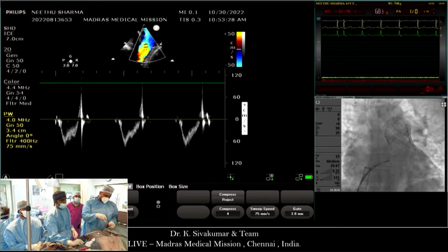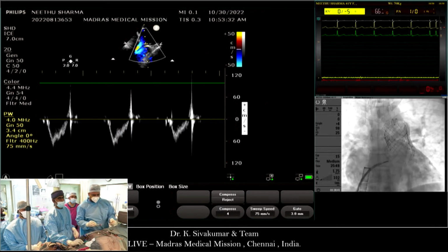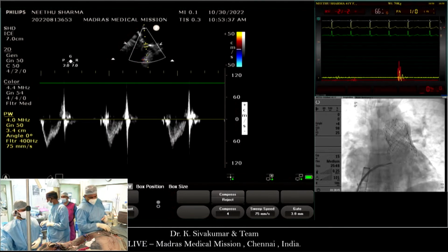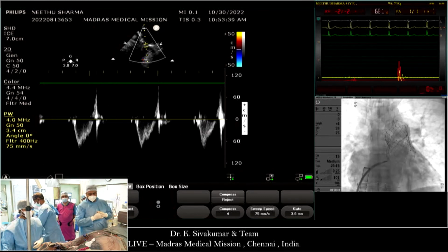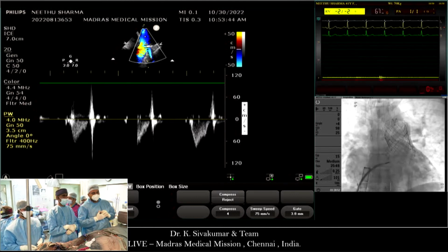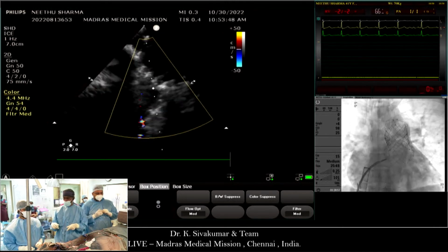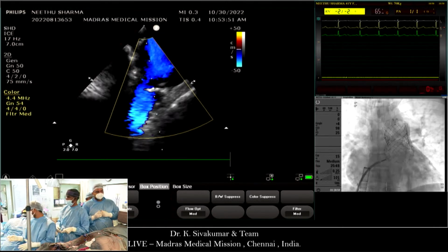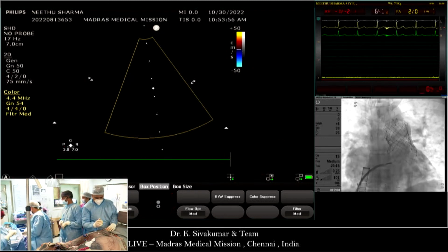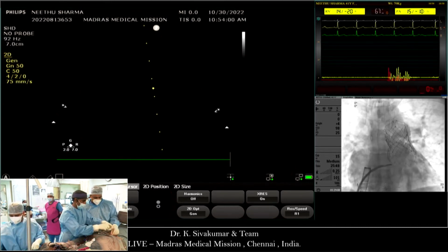This is the pulse Doppler at the level of valve. Compression study. Do you do coronary compression? Well, after the valve or before? No, before. We have done it already. Usually we find out from the CT scan beforehand. If the imaging people say to us the coronary is close by, then when we're doing balloon interrogation, we would do an aortogram or selective coronary. But otherwise, if the CT scan nowadays shows coronaries are well away, then we don't. But since this is not a balloon expandable valve. Yeah.